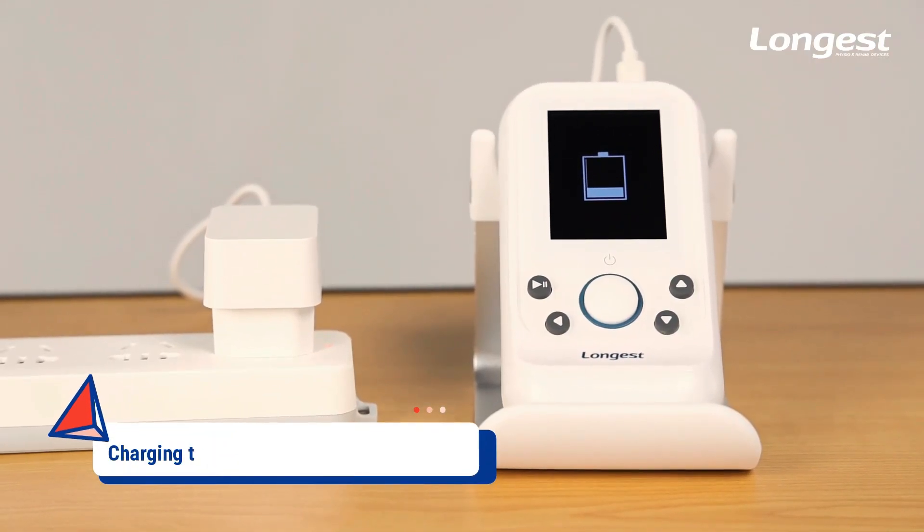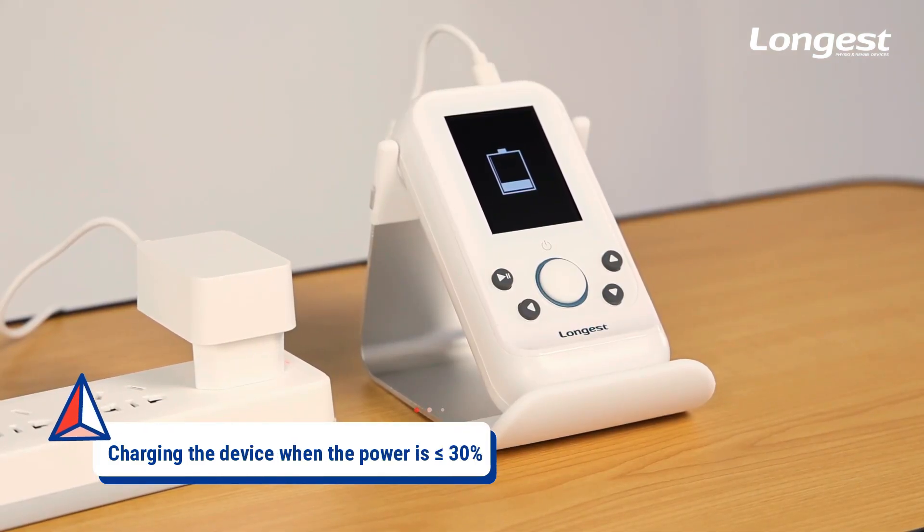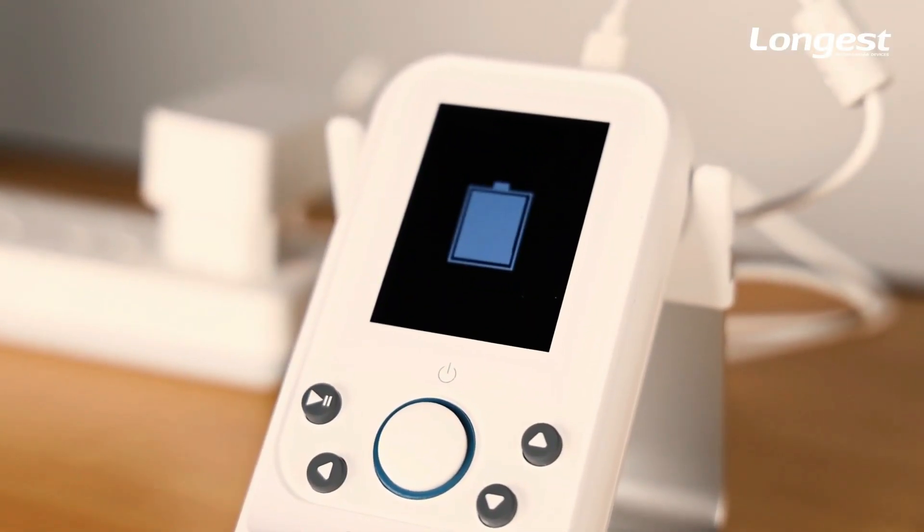Before use, please make sure the device has enough power for the treatment. It is recommended to charge the device when the power is lower than 30%. The fully charged device can work for 6 hours.